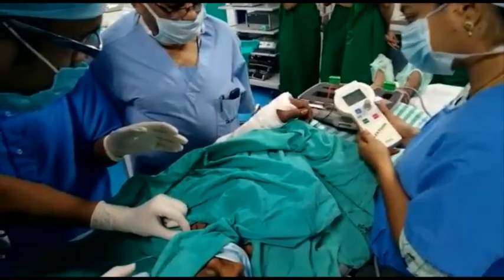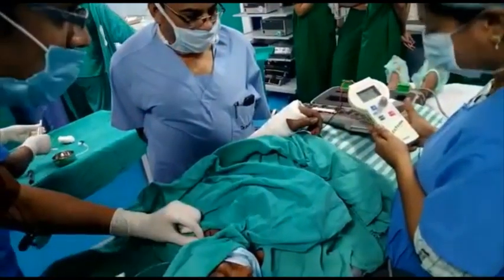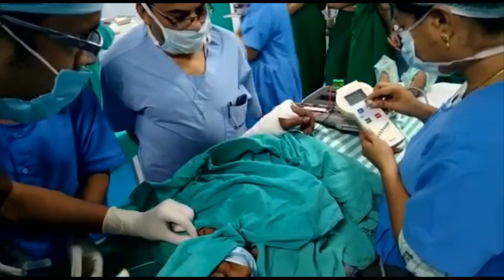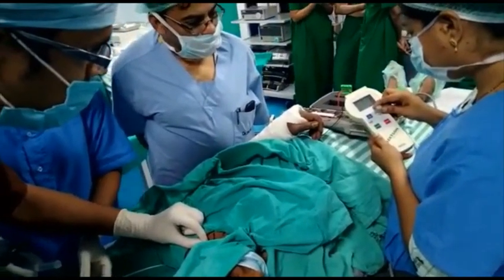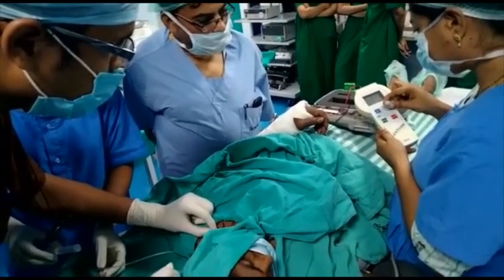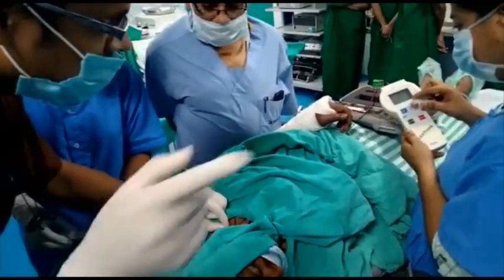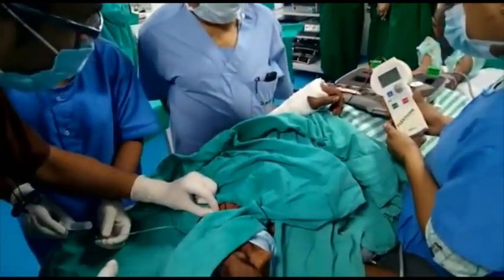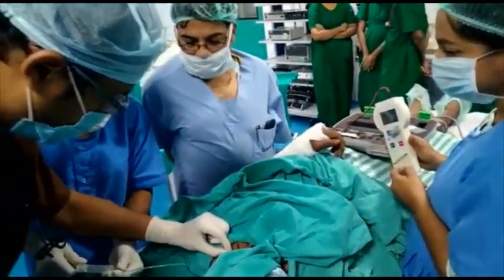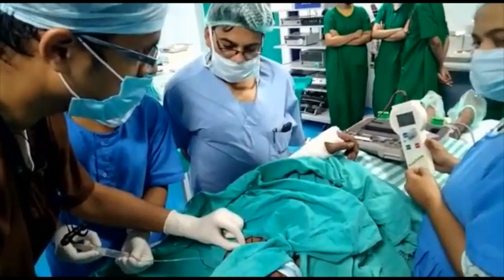Now we have to decrease the current gradually. These twitches should be present even at less than 0.5 milliampere, but should be absent at less than 0.3 milliampere. When muscle twitches are present even at less than 0.3 milliampere, it indicates intraneural placement of the needle and the needle has to be withdrawn. After negative aspiration for blood, we have to inject around 25 to 30 ml of local anaesthetic solution — either bupivacaine or ropivacaine.